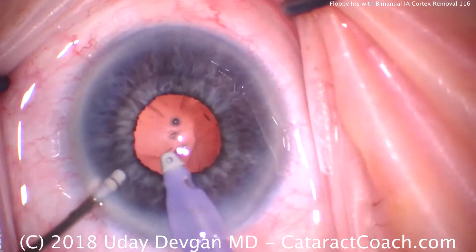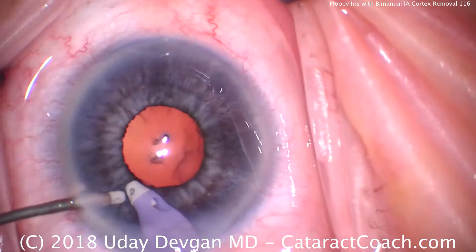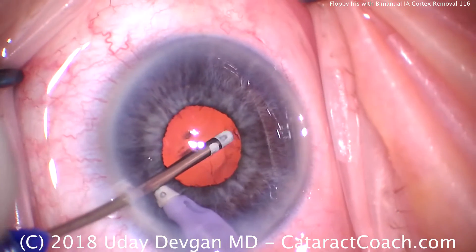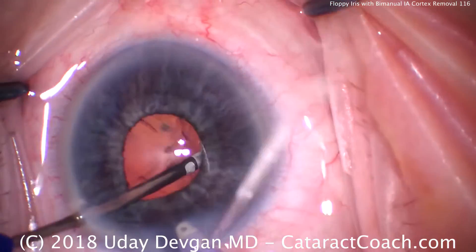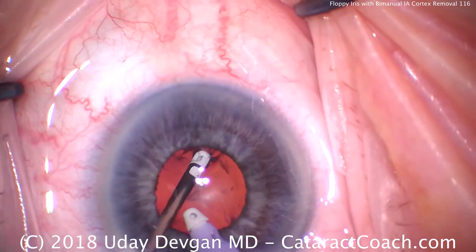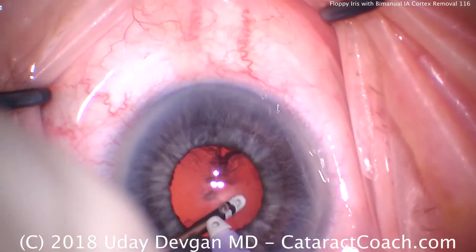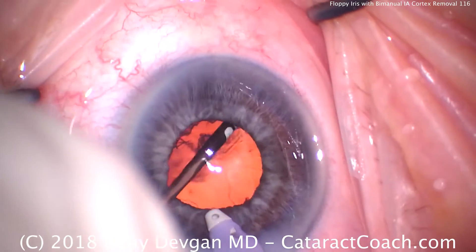There's the infusion. You can see how small the pupil is at this point. We'll take the aspiration port — that's in the left hand — and go under the iris. We want to grab bits of cortex and strip it centrally. It's not easy because we're not directly visualizing it, so just take our time. There's quite a bit of cortex that's really stuck on there.